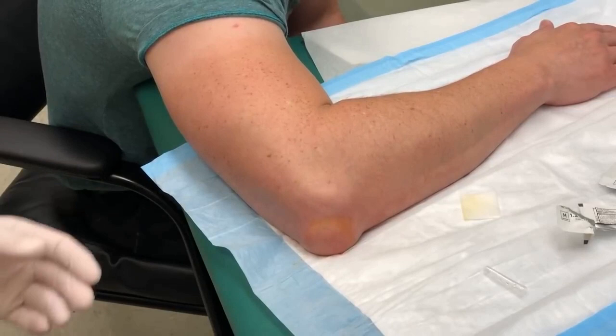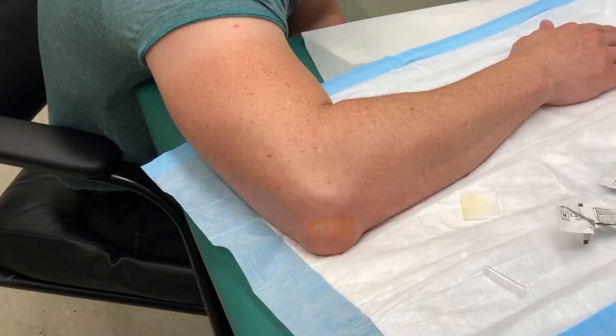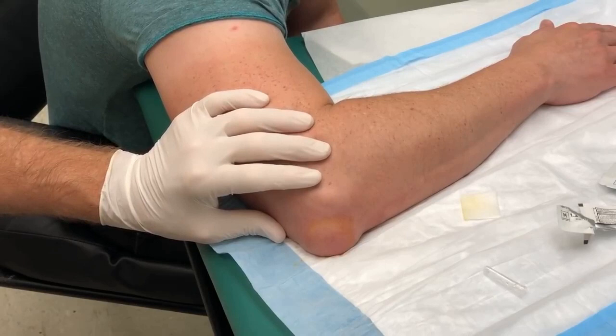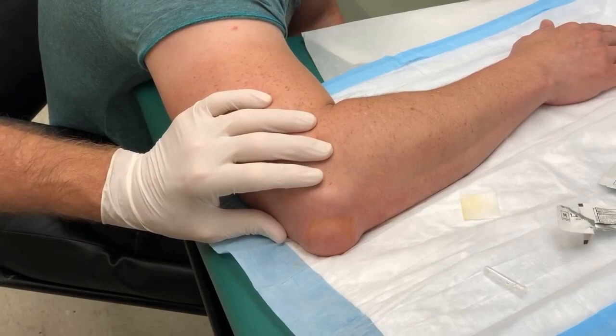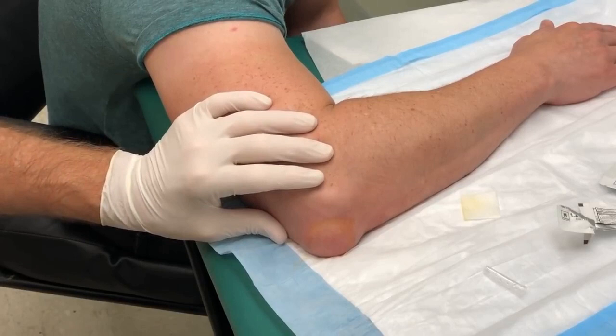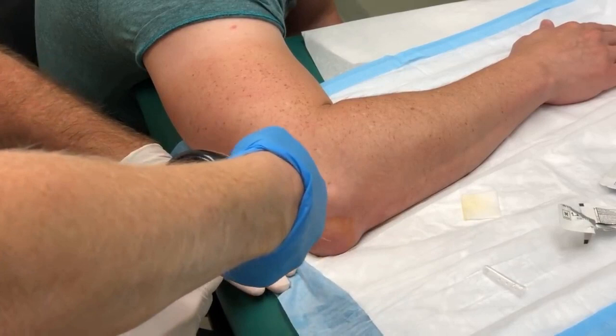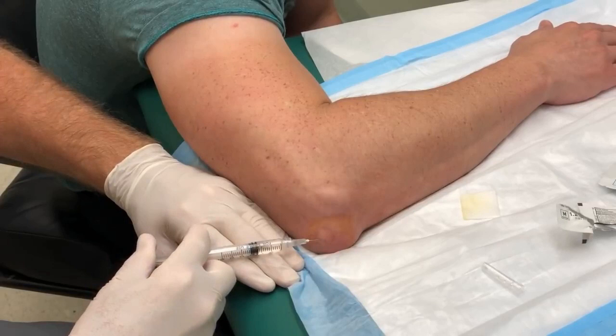The nurse has arrived — do you have the cold spray? What gauge needle do you want — 18? Okay, we'll use the 18. Do you have the curved hemostat? You did great, you are ready to go — she's super nurse. Give me a little cold spray right there. All right, that's good. A little stick — you're going to feel a sting. There you go, we'll let that go in.